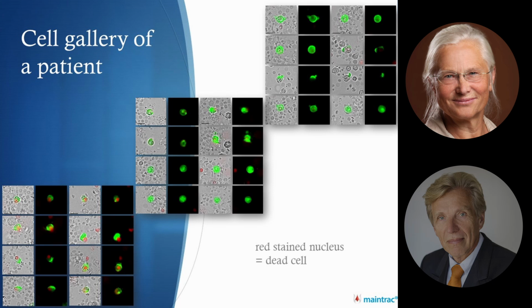These cells are more frequent than in other approaches, and we show here the cells from one patient. The right upper cells are the cells that we count. They are living. We need to see a nice nucleus, but the staining can be quite different over the whole cell or a tiny staining on the membrane.